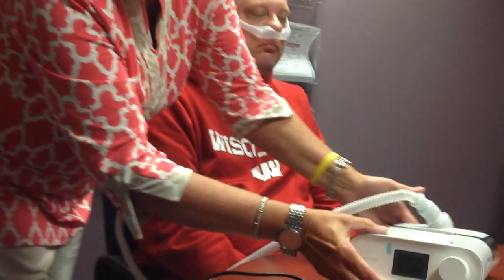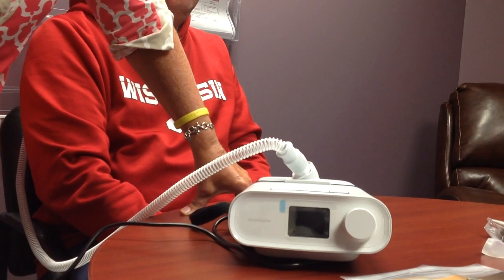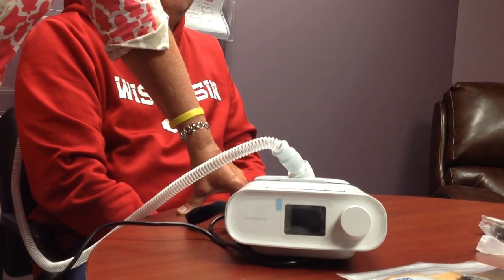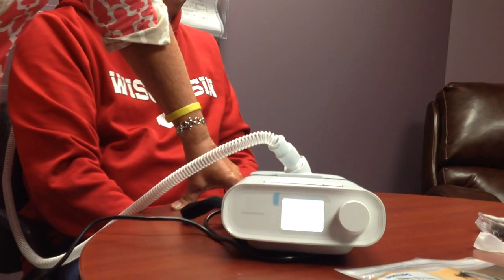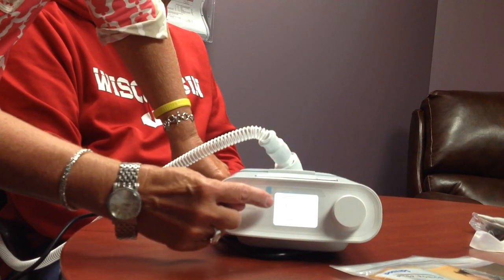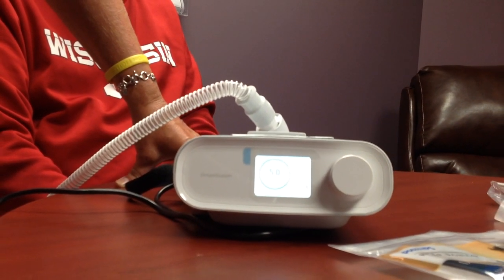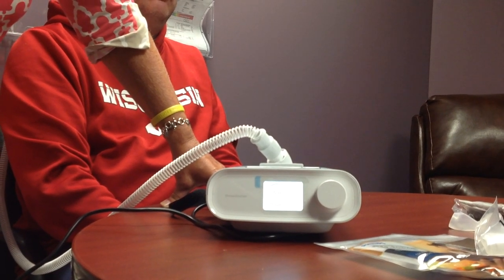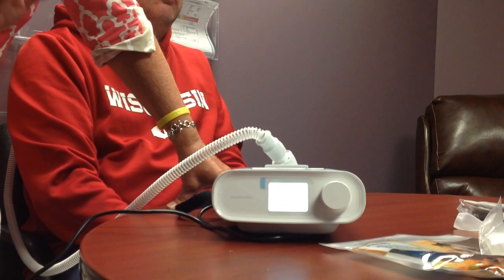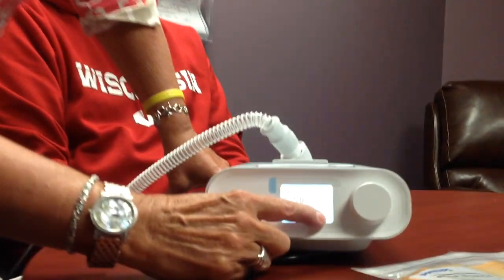As long as I have the machine on, I can show you quickly: after about two minutes your screen is going to go to black. That's good — we want to keep you sleeping and don't want that light shining in your face. If you want to see your screen, just hit the front dial and click it and it will come back on. That way you're able to see your pressure. Don't be alarmed if you start out at 5 and wake up in the middle of the night and it says 10 — that is what the machine is supposed to do. If you are set on an auto between 5 and 15, you're going to go between 5 and 15.